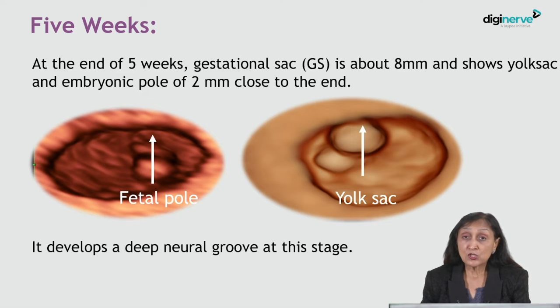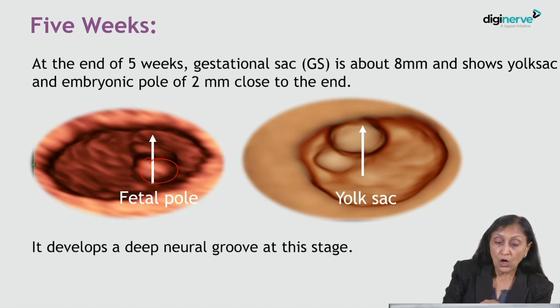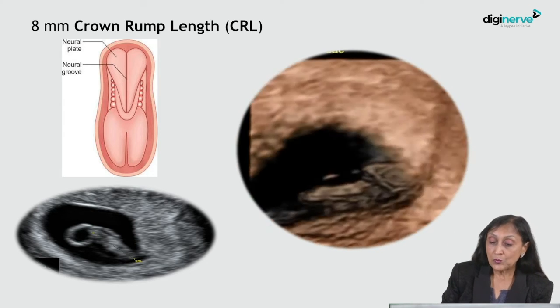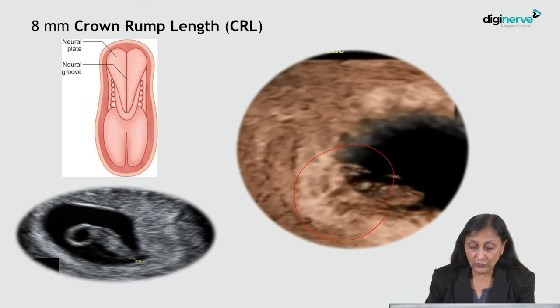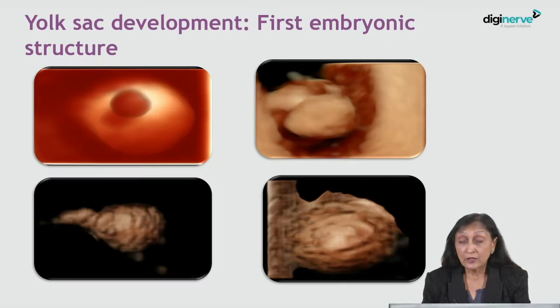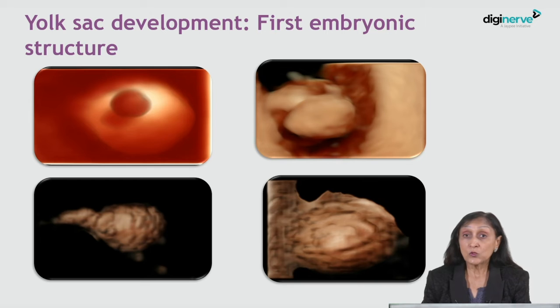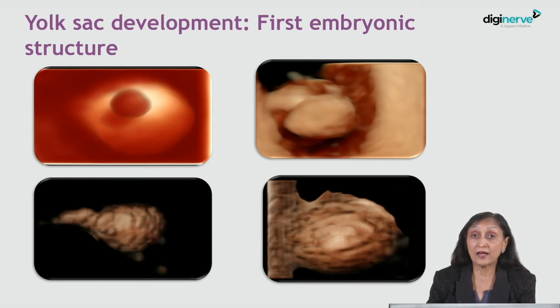At five weeks of pregnancy, you would see a gestational sac of about eight millimeters and you'll also see the yolk sac inside along with the fetal pole. The neural tube starts developing as early as that in the form of the neural groove first, beautifully seen on 3D imaging as an elevation on the back of the fetus. Yolk sac development occurs in the first trimester and starts even earlier than the development of the embryo — it is in fact the first embryonic structure that appears in the gestational sac.